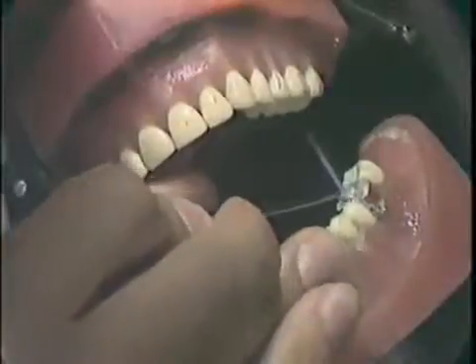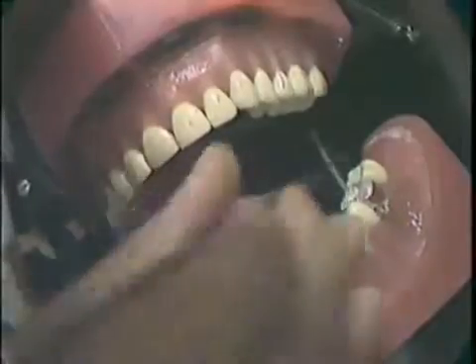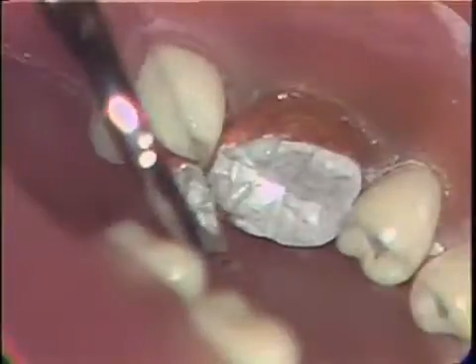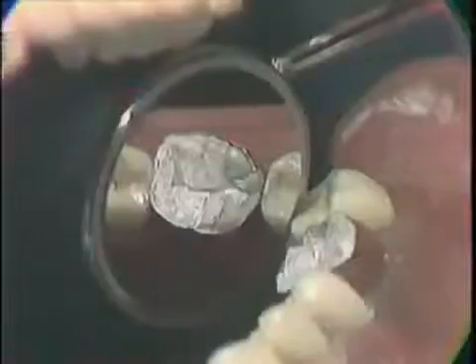Further occlusal anatomy can be carved into the restoration. The copper band is left in place undisturbed for eight to twelve hours to allow the amalgam to harden. The copper band is then removed and an ideal crown preparation can be made in the amalgam. An impression is taken, the crown fabricated, and finally the crown is cemented.